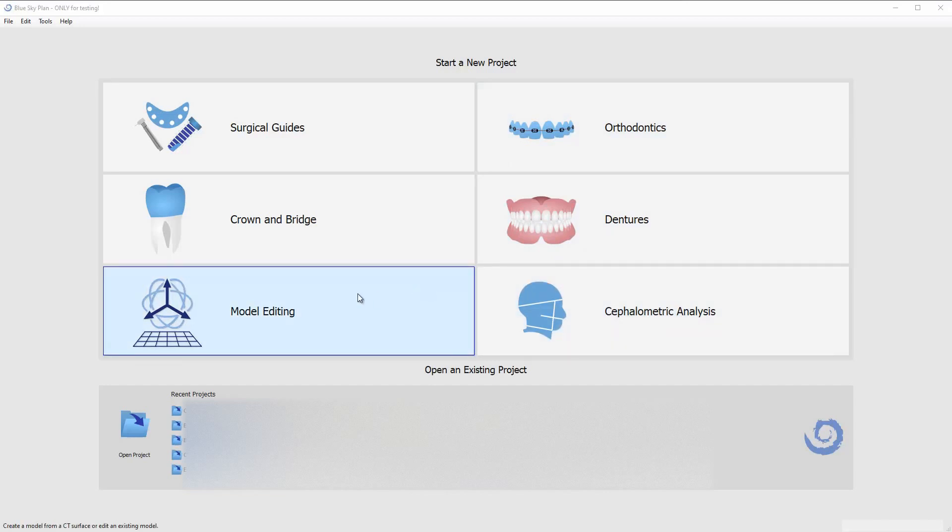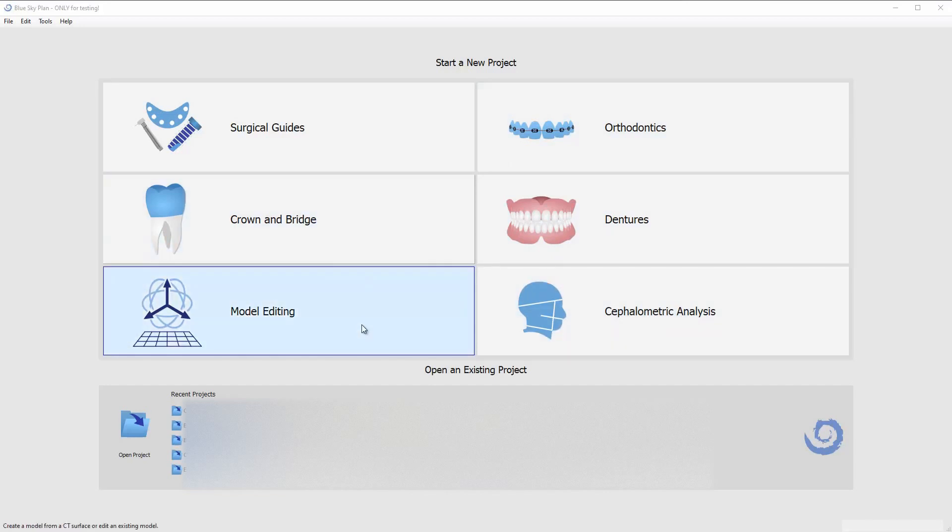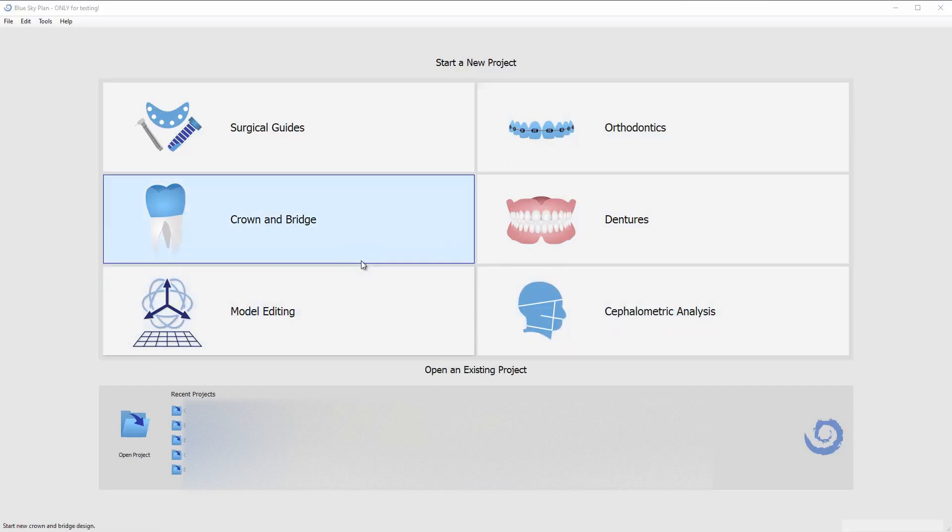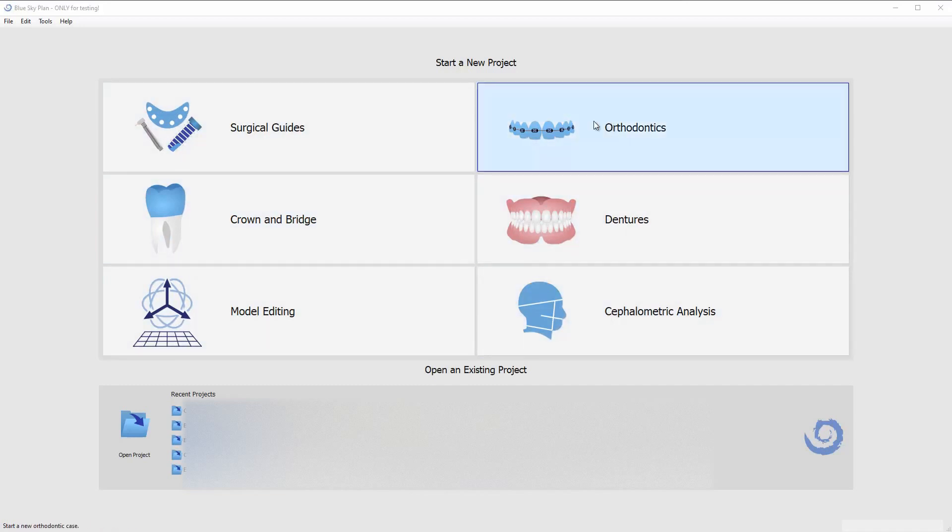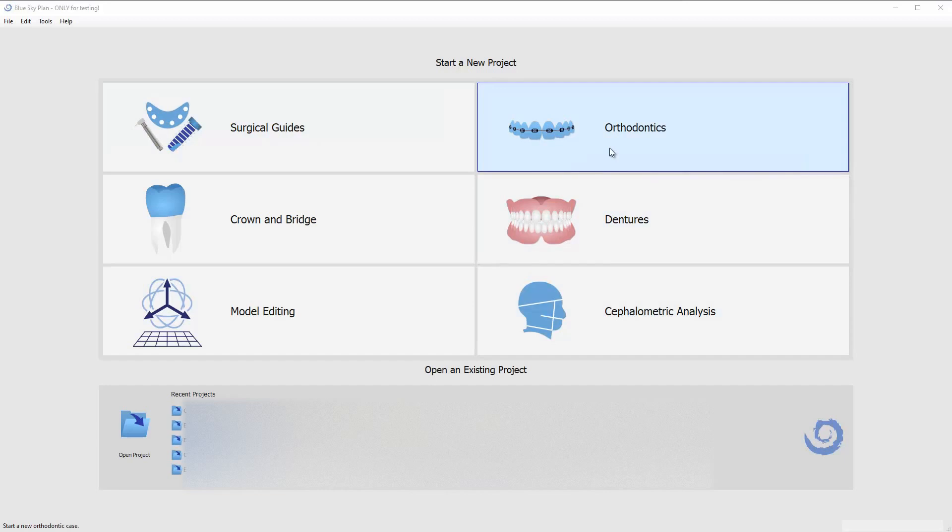Just a heads up, model editing and crown and bridge are free modules. The other ones have a fee associated with them as you export the models, the STLs that you are creating with the software. That's where you are charged an export fee. So anyway I'm gonna go ahead and move forward. A quick little tidbit about this, the export fees as they relate to clear aligners.